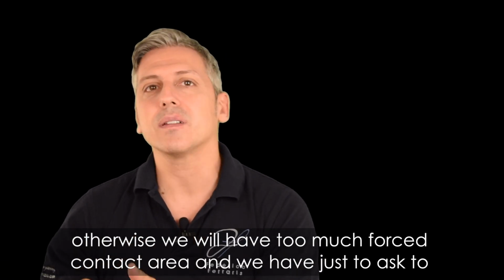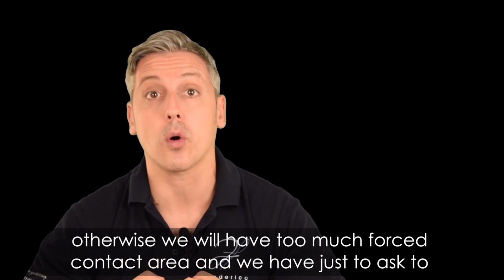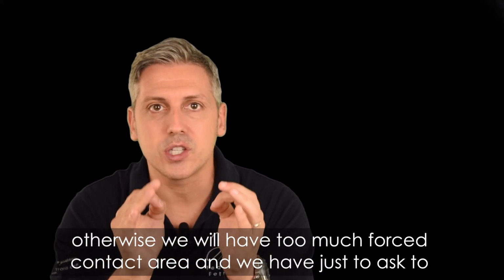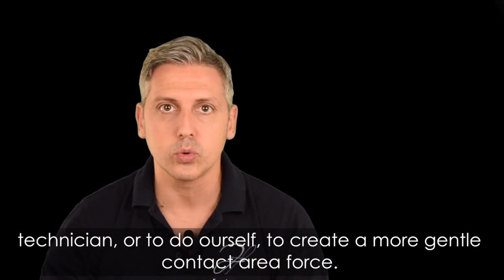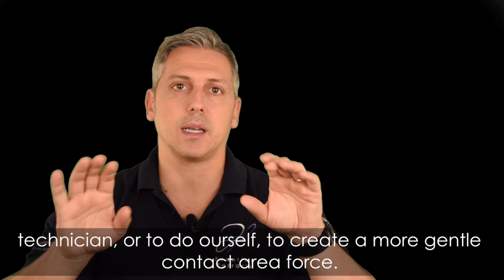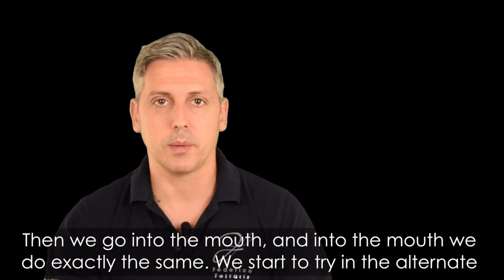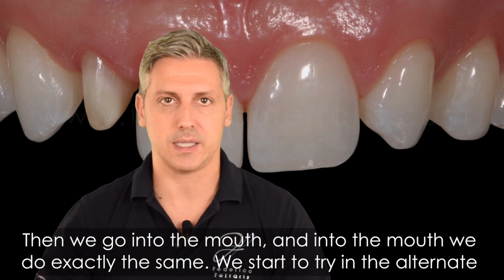Otherwise, we will have too much strength, too much forced contact area, and we have to ask the technician, or do it ourselves, to create a more gentle contact area force. Then we go into the mouth, and in the mouth we do exactly the same thing.